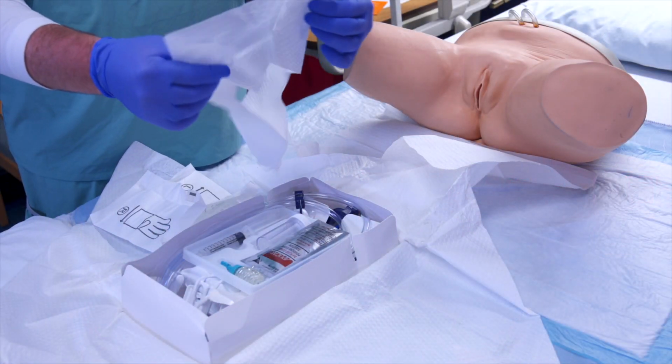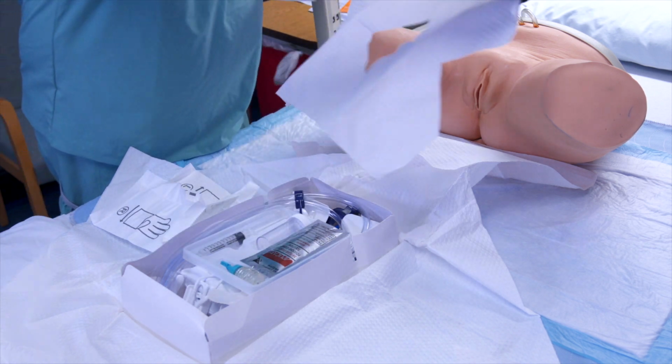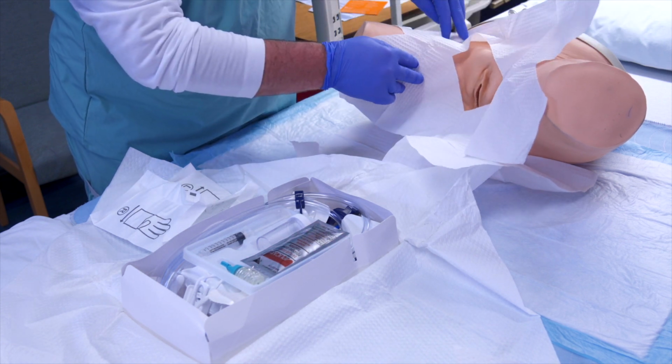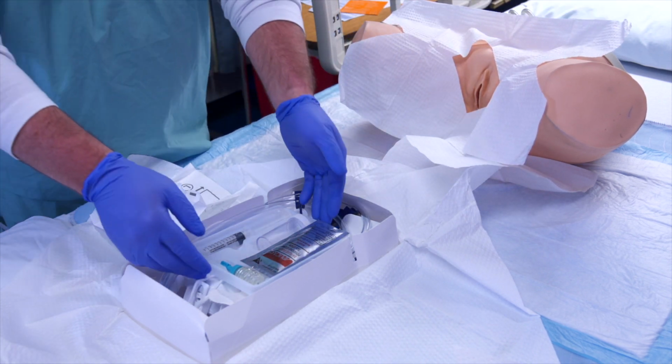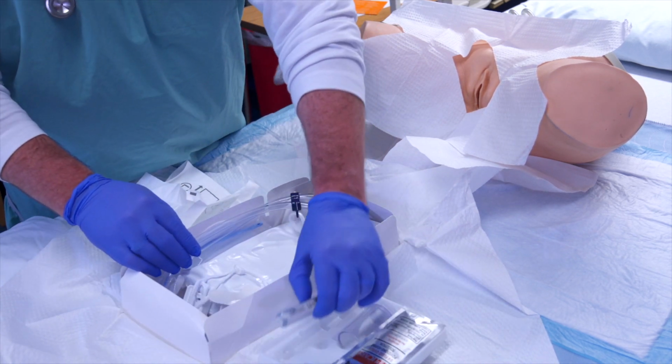Explain to the patient that you will be prepping for insertion and that they will feel your hand and the cool prepping solution. Place the fenestrated drape over the perineum. Connect the pre-filled syringe to the inflation port on the catheter. You do not need to pre-inflate the balloon.